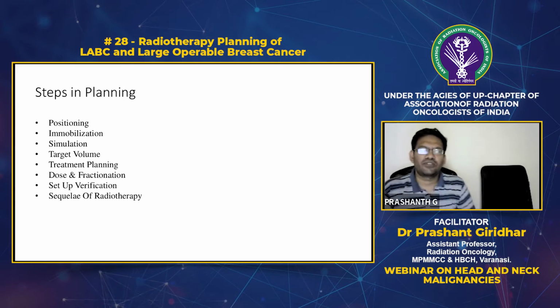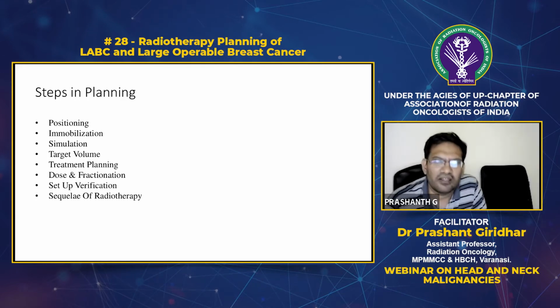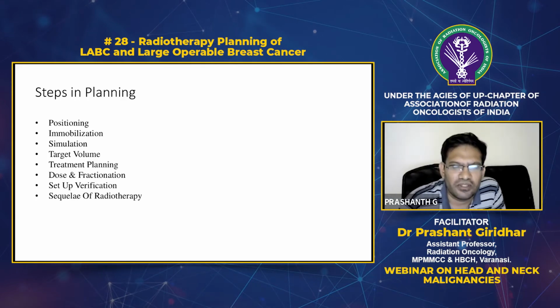So the basic steps in planning include positioning and immobilization, simulation, then you define the target volume, then you define the dose and fractionation, and then you verify the setup.